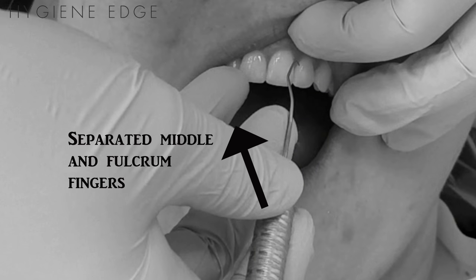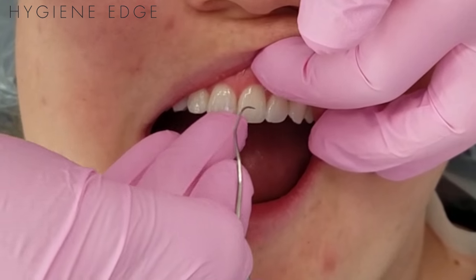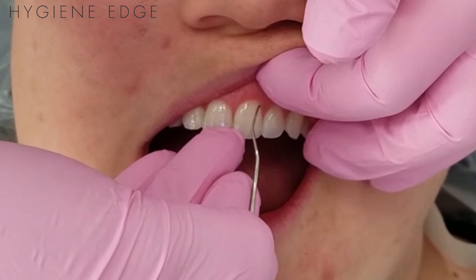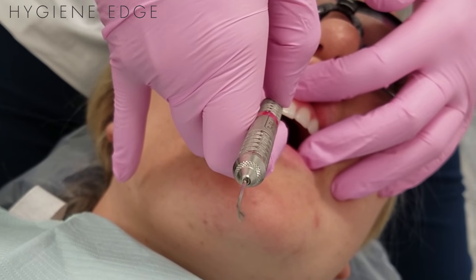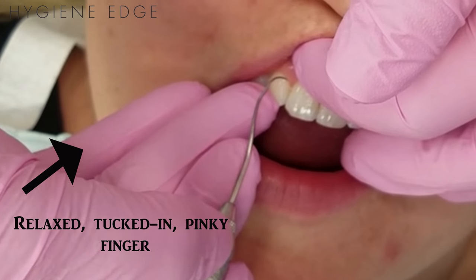For example, while treating the maxillary facial anterior away surfaces, as you move from treating number 8 to number 9, if you don't move the fulcrum finger, they will become separated, which will cause strain on the wrist and hand and make scaling more difficult. The little finger has no function and is to be held in a relaxed position, not flexed.